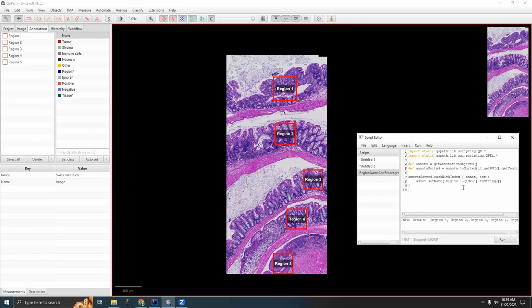Next up, it's time to actually export these regions. And there's a lot of different ways of exporting images in QuPath by scripting.